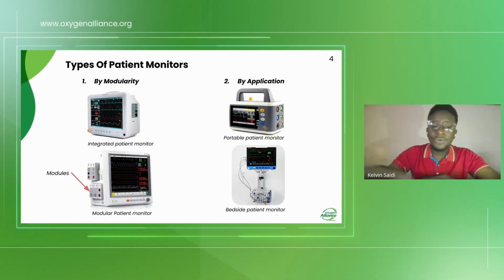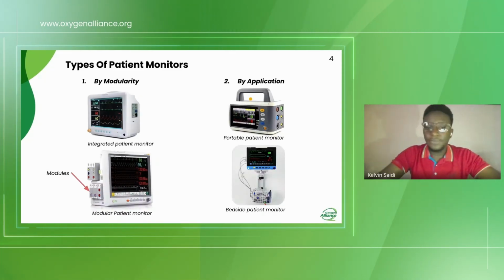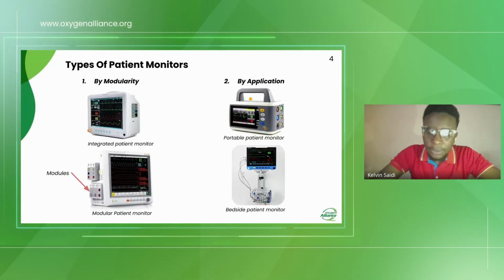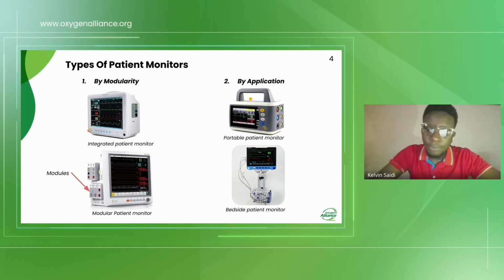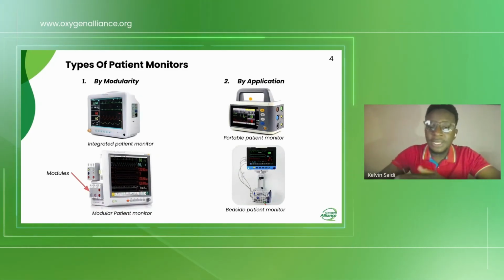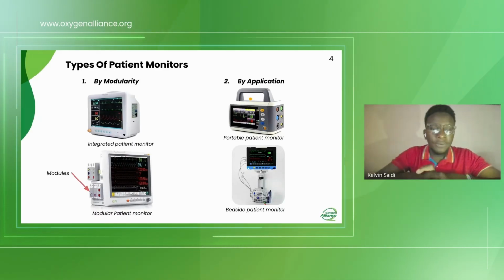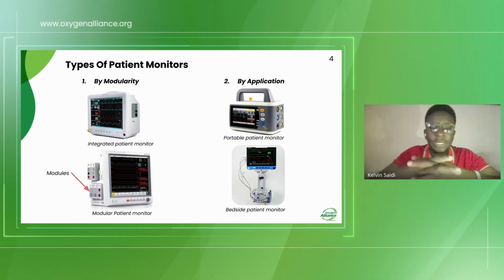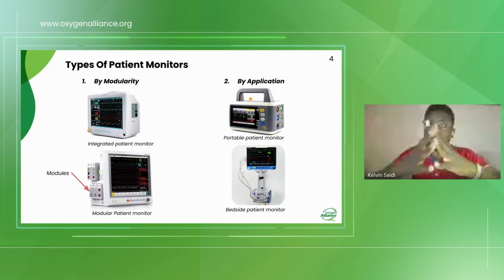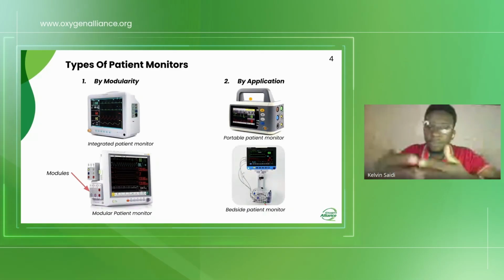So you cannot add new capabilities later, whereas a modular monitor acts as a host for swappable mini computers that are called modules. If you look at the picture, on the bottom left, you have a modular patient monitor, and you can see an example of how these modules look. These modular monitors allow clinicians to slide in specialized modules for advanced vitals, such as brain function or anesthetic gas analysis. This is done as the patient's condition becomes more complex.